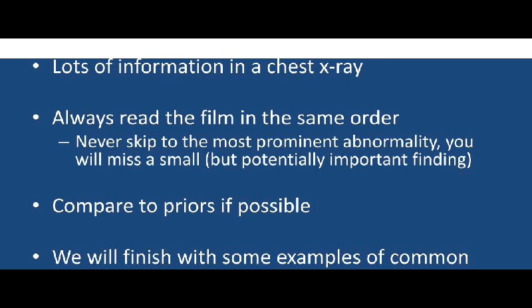That's why we have what we call a light box. That thing we place the radiograph on, the one that emits light, so that when we are looking at these lesions, because there can be tiny micro calcifications that you might miss if you just look at the chest on a normal basis.